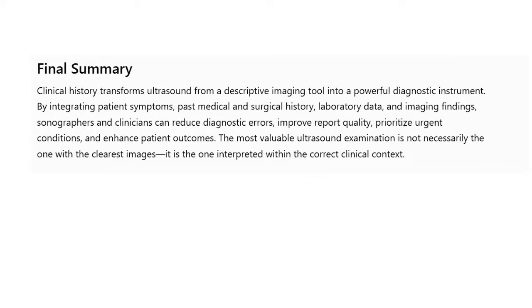So the final summary, clinical history transforms ultrasound from a descriptive imaging tool into a powerful diagnostic instrument. By integrating patient symptoms, past medical and surgical history, laboratory data, and image findings, sonographers and clinicians can reduce diagnostic errors, improve report quality, prioritize urgent conditions, and enhance patient outcomes. The most valuable ultrasound examination is not necessarily the one with the clearest images. It is the one interpreted within the correct clinical context.